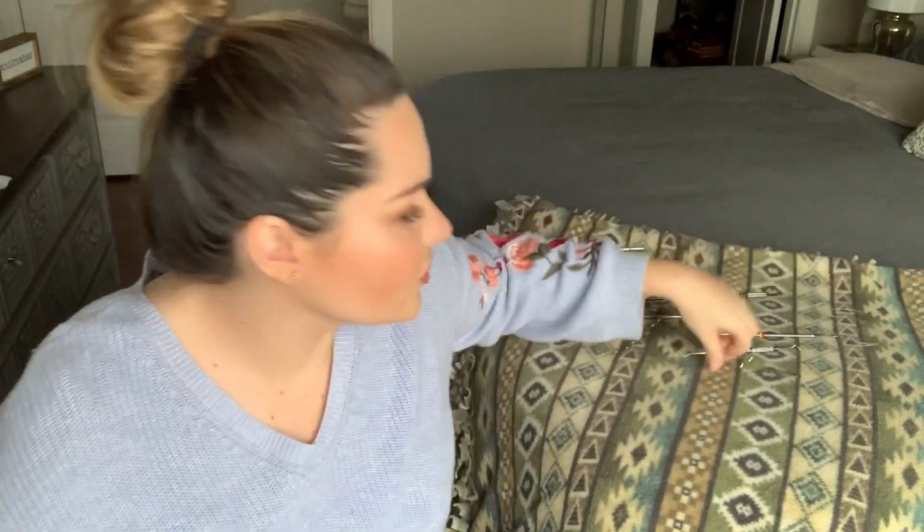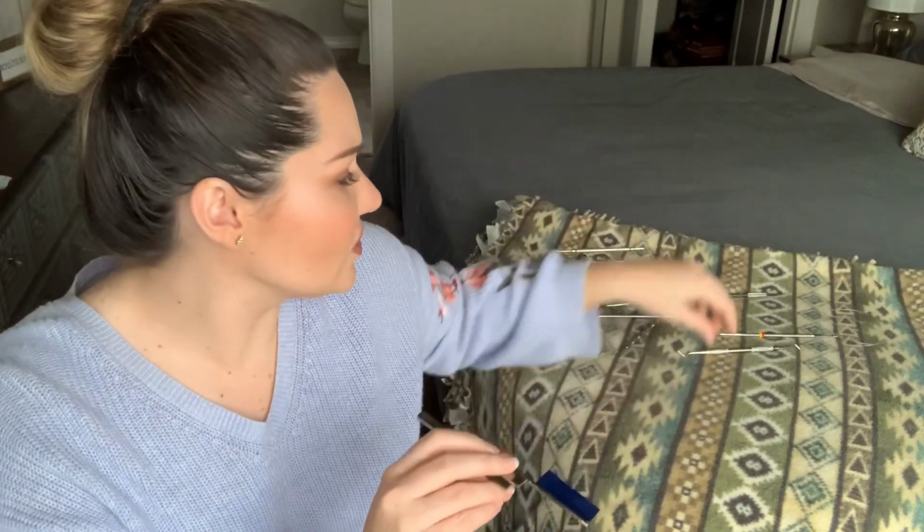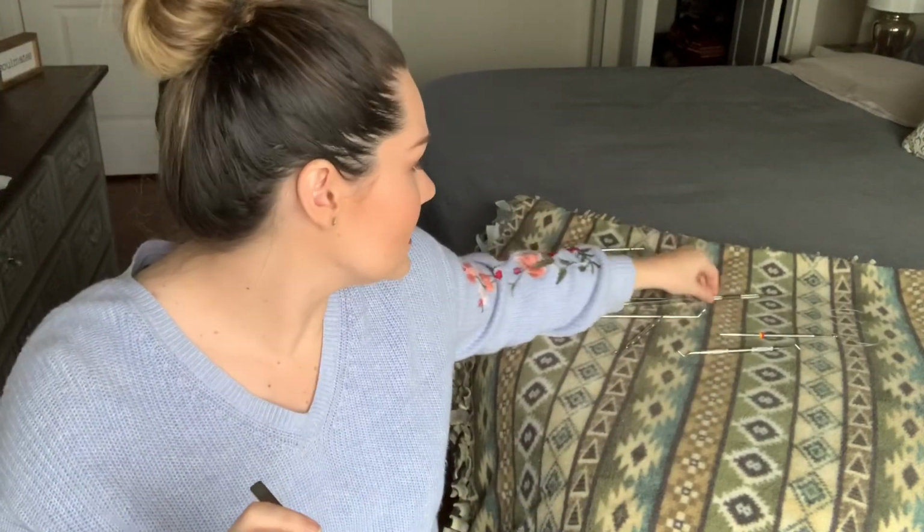And then I will hand him floss so he can check the contacts. If there's not a contact, we go directly to the occlusal paper. Then the patient's going to bite on the occlusal paper. And while he's doing that, in my hand, I have the carver ready to go because if it's high, he's gonna need to carve away some more amalgam. So let's say the filling's high. So I give him back the carver so he can carve the amalgam out. And then I give him back the paper so we can check it. And then he's like, all right, looks good.